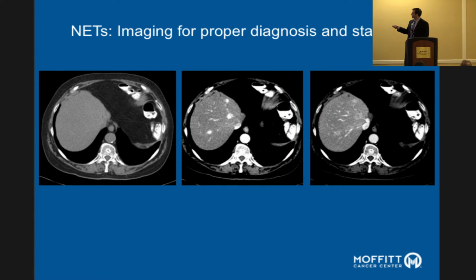There might be smaller ones that would be hard to pick out from the vessels, whereas over here they stand out much more clearly. Also, if you don't have these time points, it's harder to figure out how you're responding to therapy, if it's a medical therapy that is supposed to decrease the enhancement, like an anti-angiogenic drug somebody mentioned earlier today, or one of the therapies with the interventional radiologist putting medicine in or cutting off the blood supply to the tumor. Then you've got to see decreased enhancement. So this is why when you get scanned, if you have metastatic disease in your liver, it's frequently going to be more than one scan. And hopefully your doctor, if they're experienced with neuroendocrine tumor, should be aware of that and realize that it's important to do that.